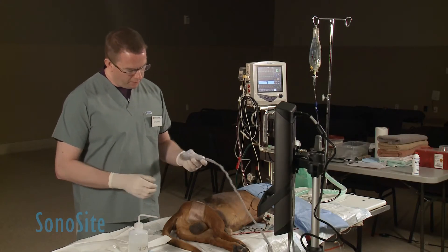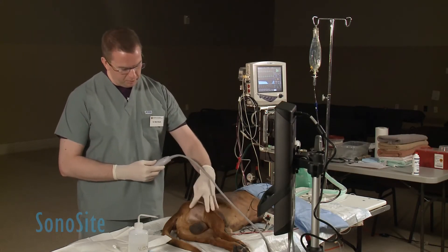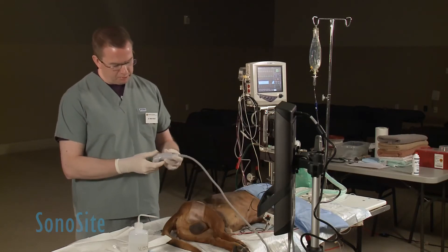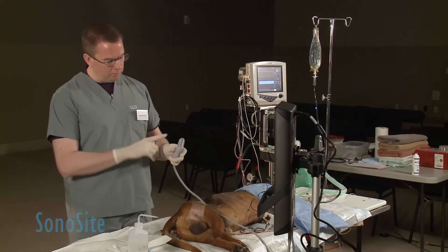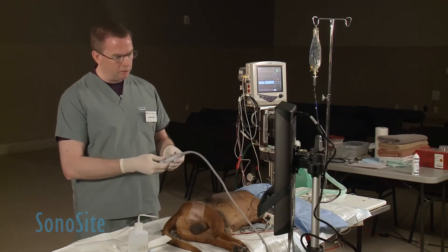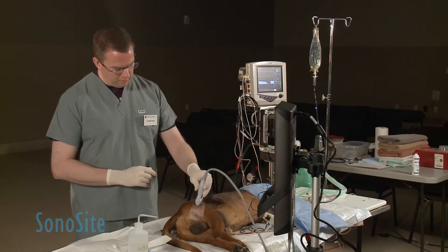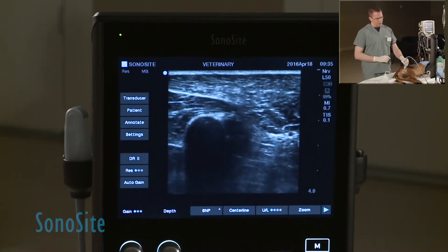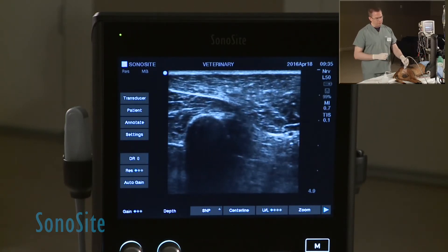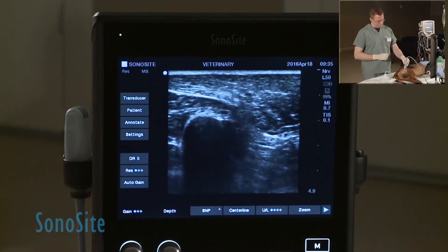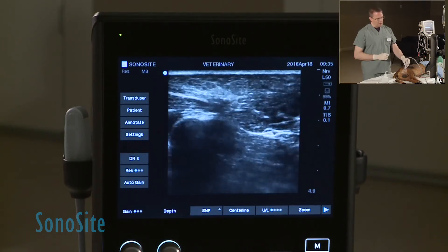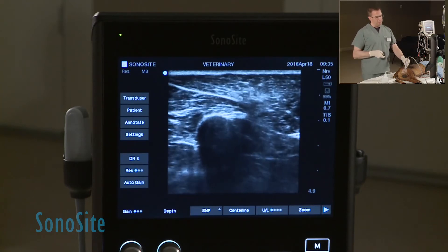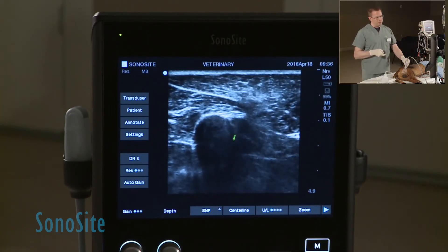We identify the biceps femoris muscle as our main soft tissue landmark. We're going to place the transducer with the marker on the cranial side of that muscle so that the left side of the ultrasound monitor is cranial and the right side of the ultrasound monitor is caudal. The first landmark that is easy to identify is this large round structure, and that's going to be the femur.